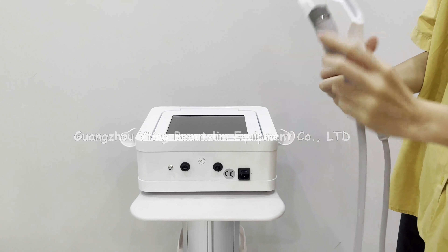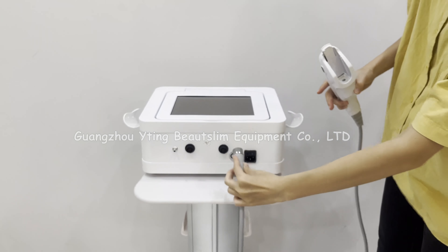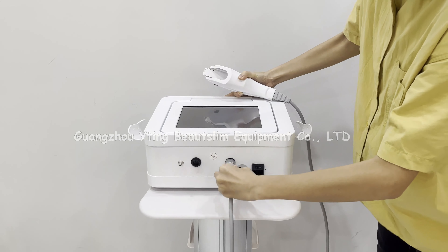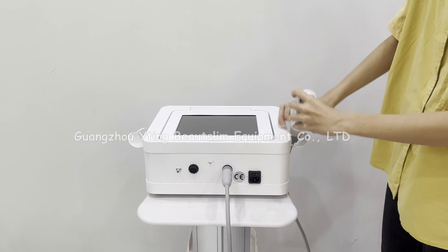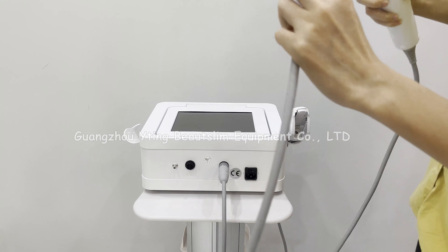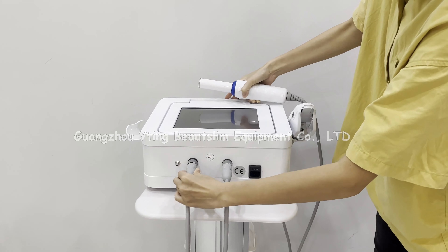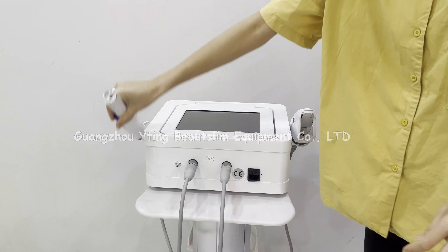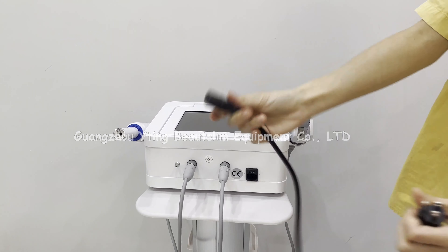First, connect the HIFU handle. You can see the arrow — follow this direction and push. You can hear a sound, which means the handle is locked. Also, follow the arrow for this connection as well.